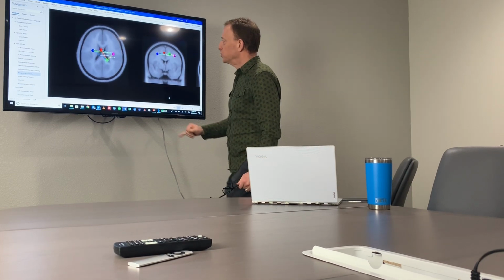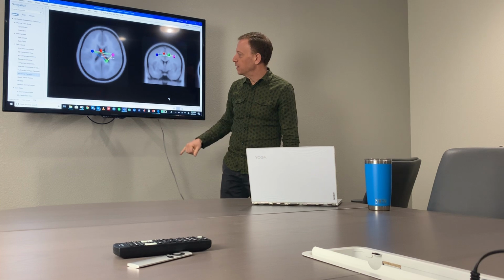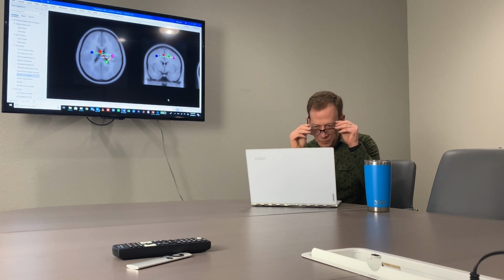So in this picture, you'll see there's arrows pointing in certain directions. Like there's 2 pointing to this one in the right parietal lobes there. One up in the frontal lobe, one over to this right temporal region. And those become sort of weaker areas in the regulation of activity. So for her, we see most of that over on that right side around parietal, central, temporal, and frontal regions.